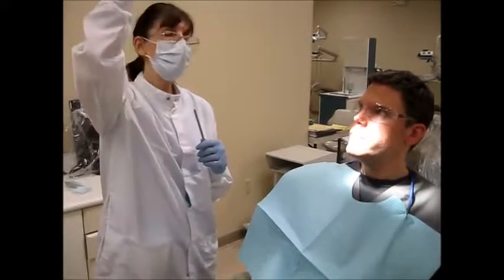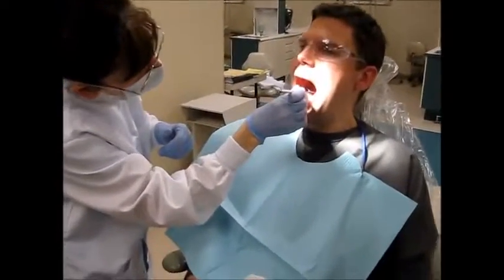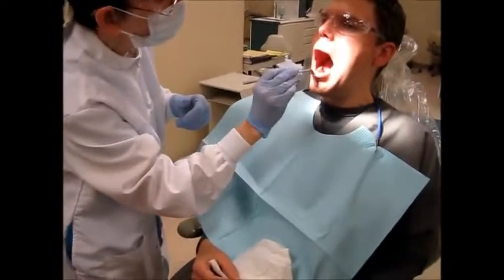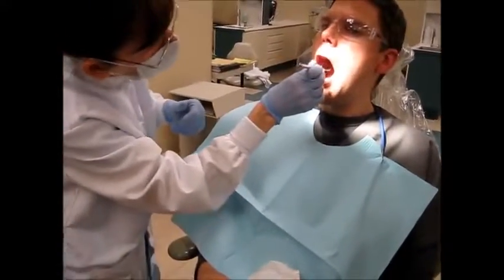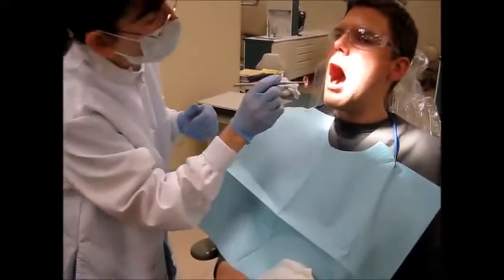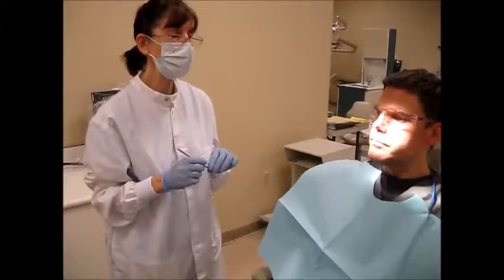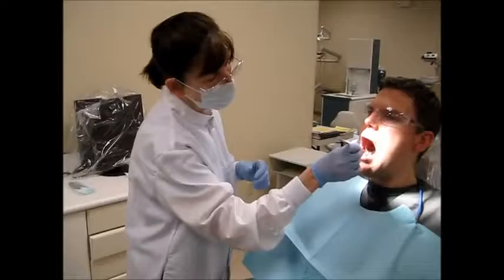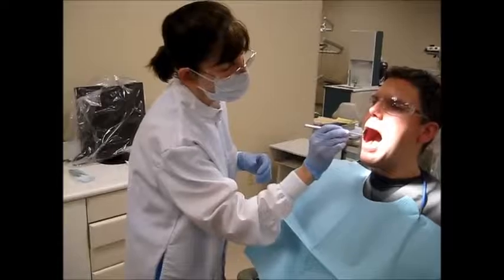Then the student would take the mouth mirror and they would observe the tissues without hitting the teeth, looking at the palate, the soft tissues of the buccal and labial mucosa, the tongue, and lift the tongue to the roof of the mouth and observe the floor of the mouth to ensure that there are no irritations of a red or white nature. And then the student would at that point in time inform the faculty that they had completed the fluoride treatment, and they would ask the faculty to come over and go through that same procedure, assessing the soft tissues to ensure that everything was intact and there was no irritation at all.